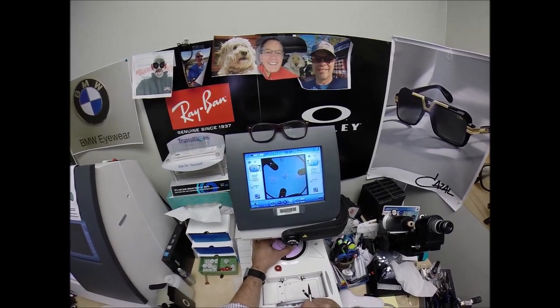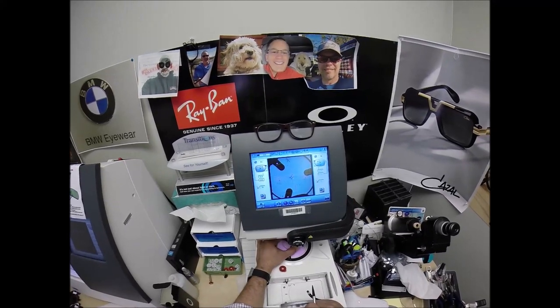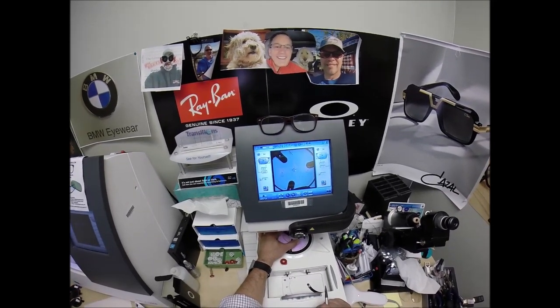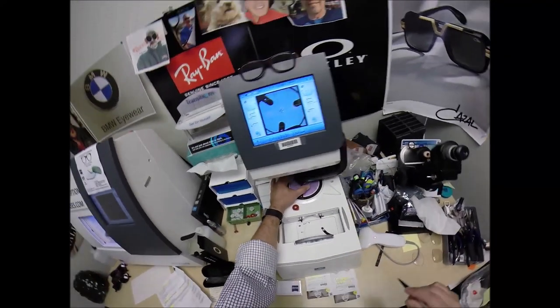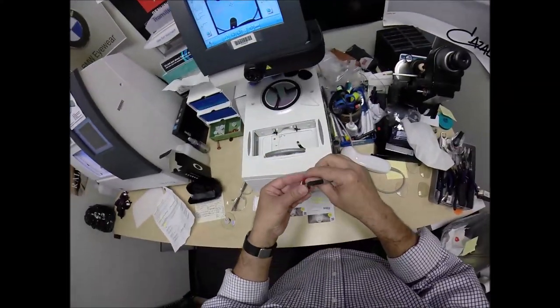Enjoy this moment of silence. Always shut up when I block lenses. It's my tell. I get quiet when I concentrate. I'm aiming. I'm the sniper. I'm lining up the vertical and the horizontal crosshairs to make sure everything is perfect. Hit that button. The arm comes down, places the block onto the right lens. I'm talking, so that means I don't have to concentrate anymore.